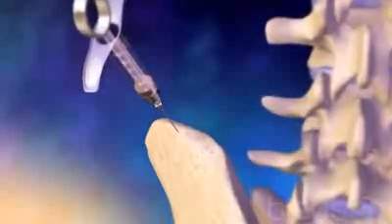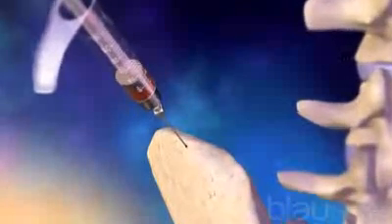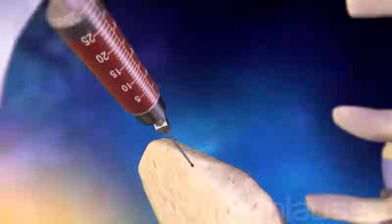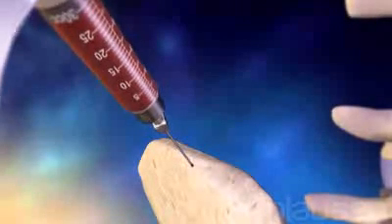Bone marrow biopsy uses a long needle to remove cells from the bone marrow. Following administration of a local anesthetic, a large core needle is inserted into the bone. In adults, the sample is usually taken from the back of the hip bone. When enough bone marrow has been obtained, the needle is removed.